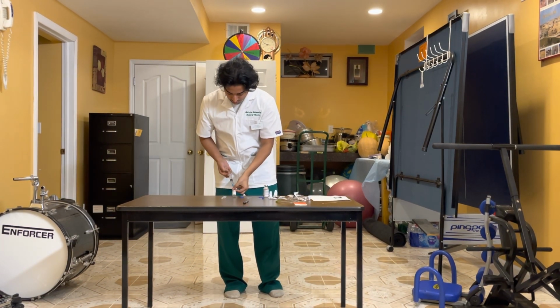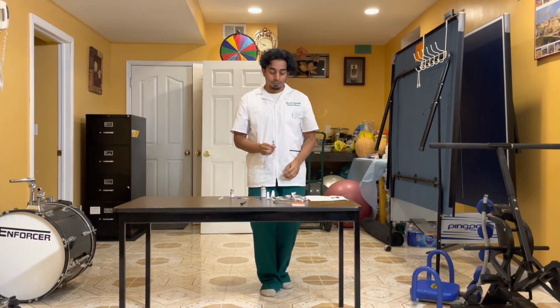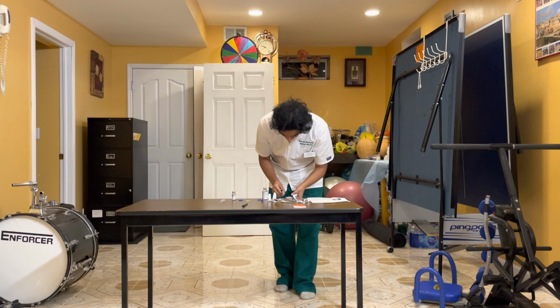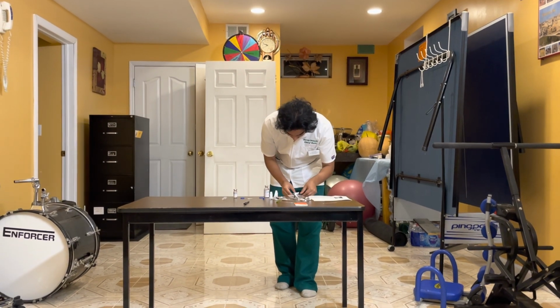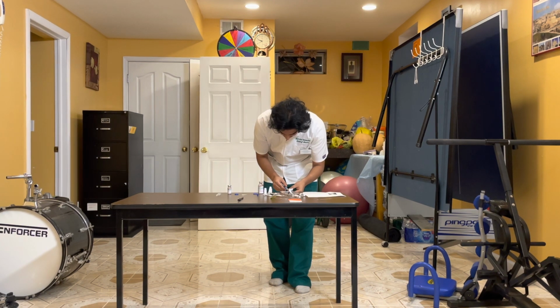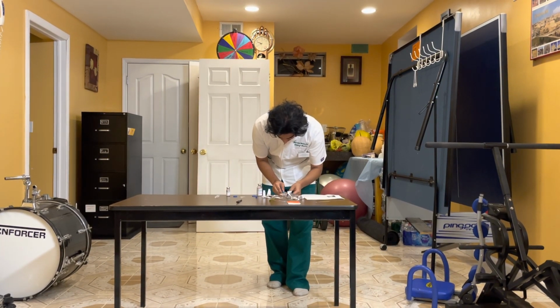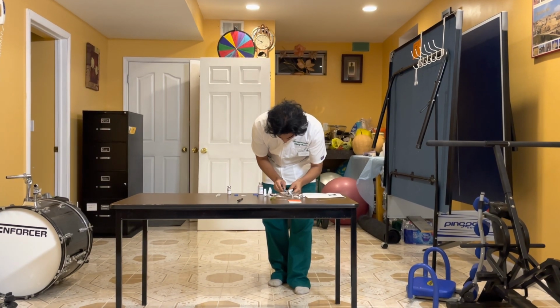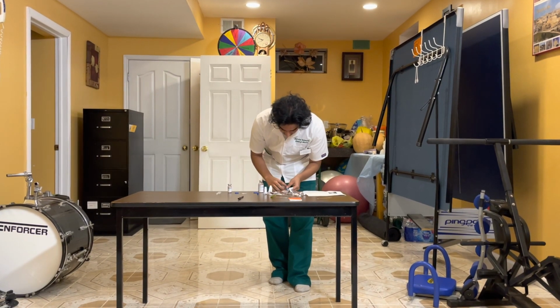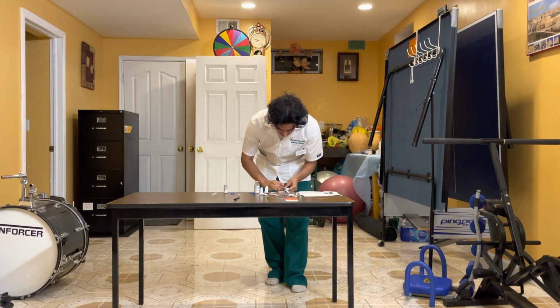Perfect. Now that I have the 6 milliliters, I will be inserting it into the IV bag. Okay. Once it's in, I will press into the.